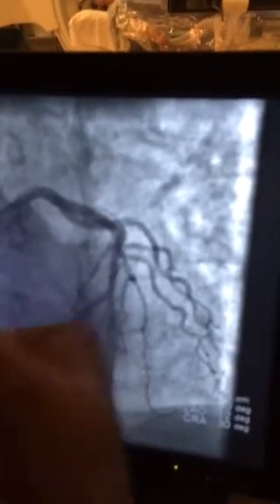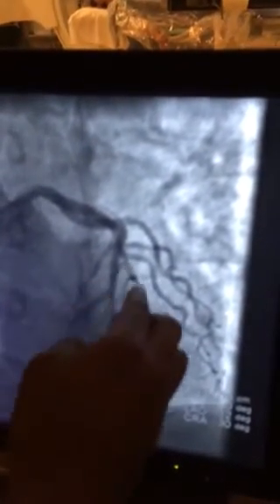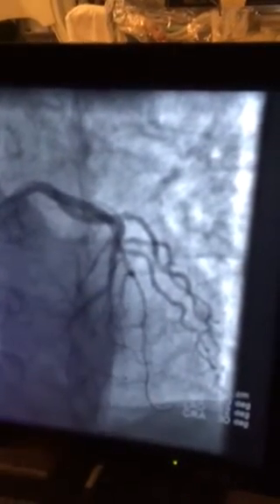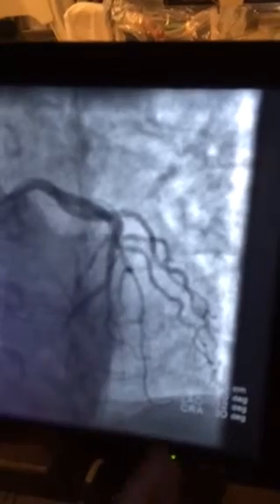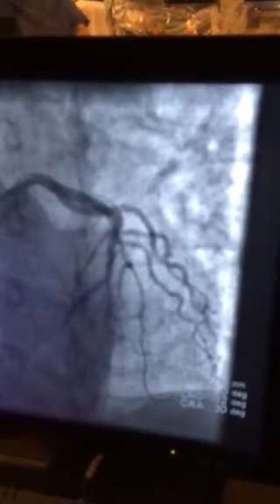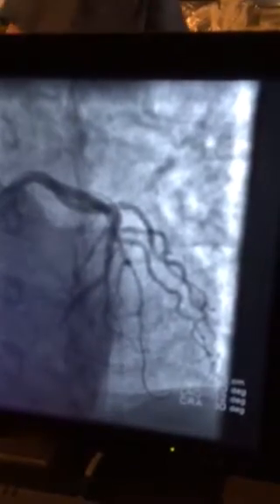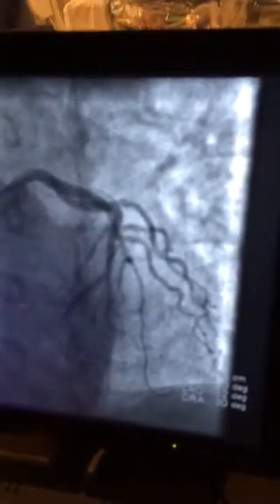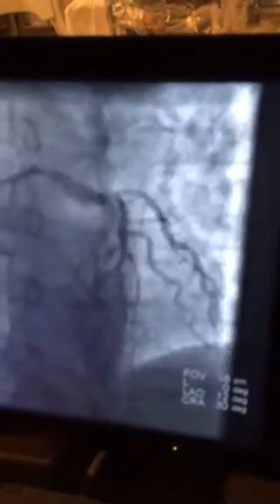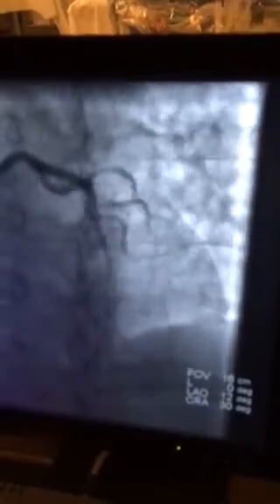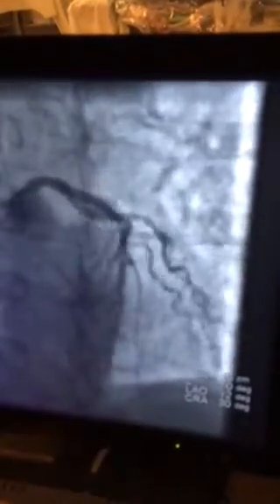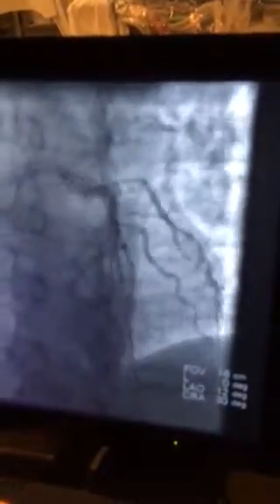And this flap, if it comes in the circulation of blood, blood can take it downstream all the way and shut off the artery in some circumstances. We were not anticipating it here — we already had our wire across. And the patient is totally asymptomatic.